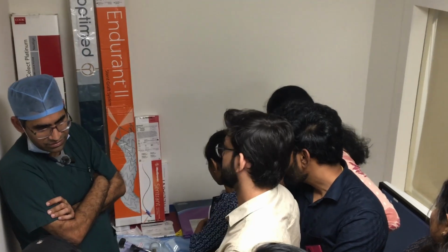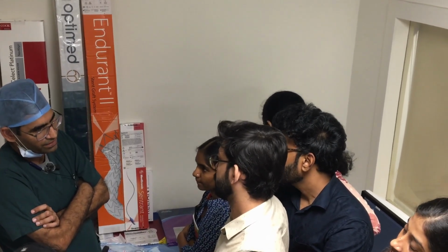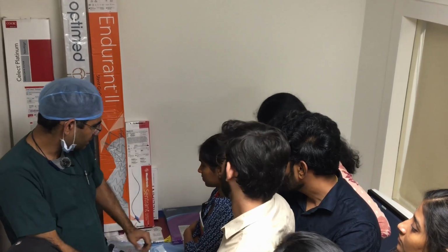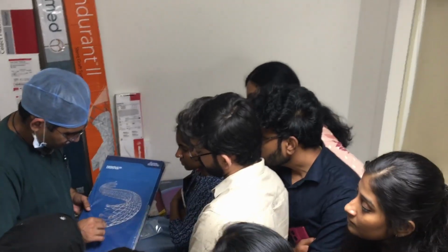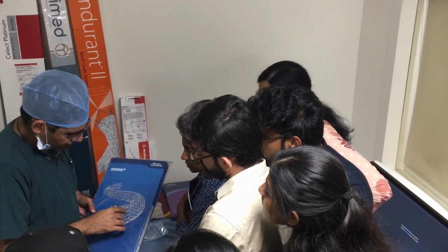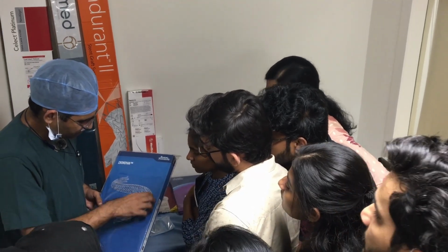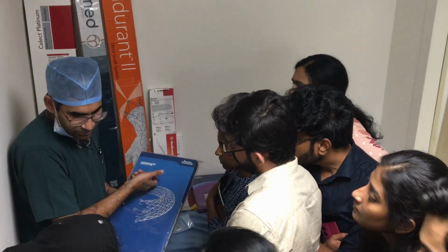Stent designs: one is the open cell design, and one is the closed cell design. Open cell, you can see in this picture, is made of multiple rings, and the rings are joined together. So what is the advantage? It has flexibility. If the vessel is tortuous, it will take that shape.